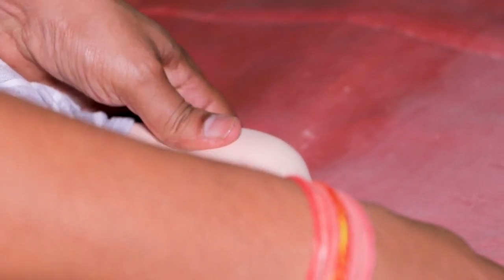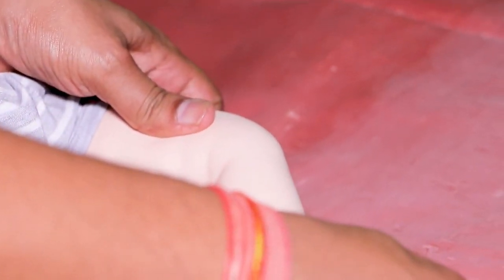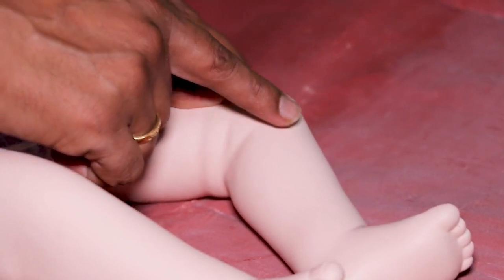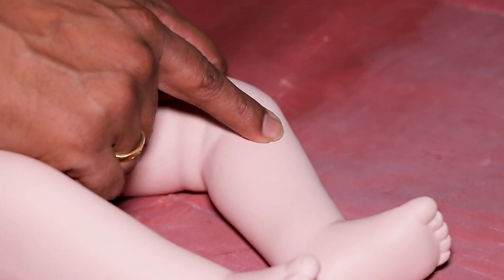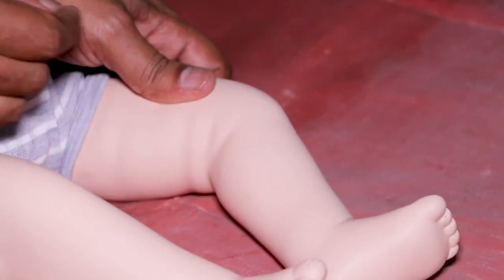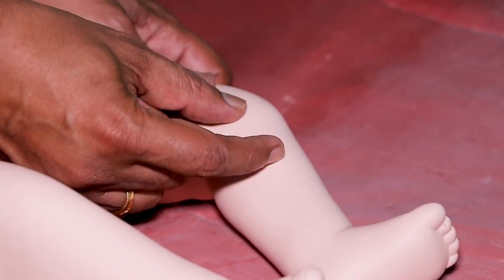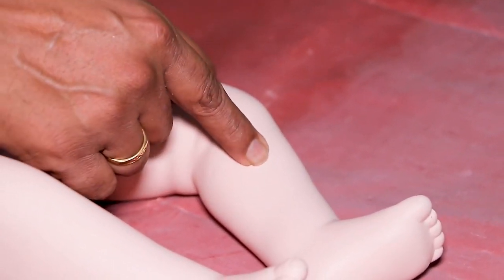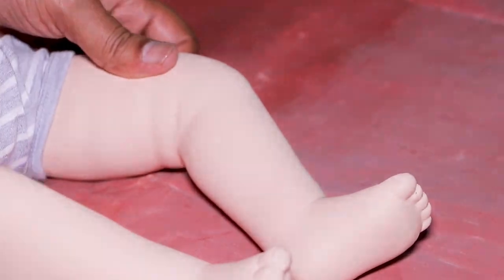The appropriate position in a younger child less than 6 years old is the proximal tibial plateau, 1 to 2 centimeters below the tibial tubercle on the anterior medial surface. In an older child, the junction of the upper and middle thirds of the tibia on the flat medial side. It is important to avoid the growth plates when inserting an IO needle.